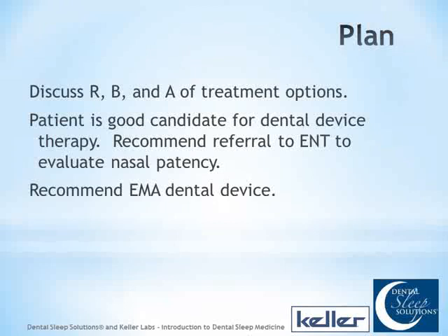Then, is the patient a candidate for dental device therapy or not? And do we have any other noteworthy items in our plan? Do we want to refer them to another doctor for evaluation or something like that? We can consider ear, nose, and throat doctors, cardiologists. The list goes on, and then we'll talk about what our treatment recommendation is.